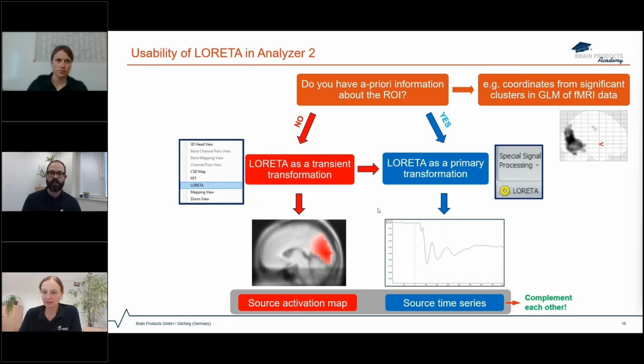So is it possible to add more markers in the EEG continuous data after data collection? The short answer would be yes, using the edit markers transformation. It depends on what kind of markers you want to add, but you can find further information on that in the manual and so on. Anything to add, Mikhail, or is that enough?